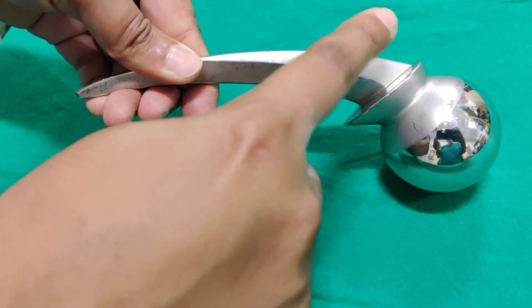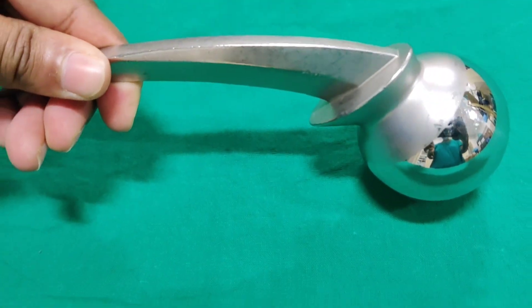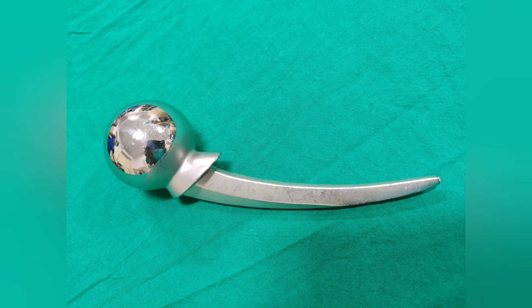This prosthesis can also be used in a patient with a deficient calcar, or if the calcar is less than 1 cm. The indication is fracture neck of femur with a deficient calcar.